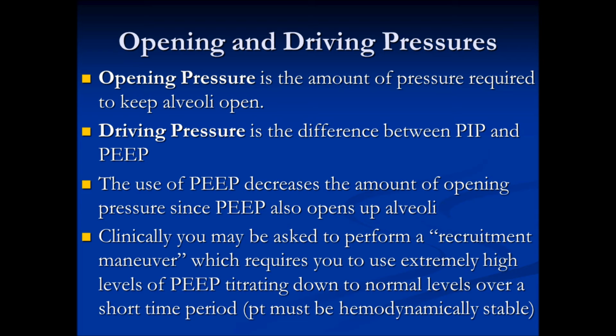Where you're starting from is your PEEP, and where you're going is your PIP. The difference between those two numbers is essentially your driving pressure. The use of PEEP decreases the amount of opening pressure that you need, because if you have PEEP, that means your alveoli are already open before you even start the breath.